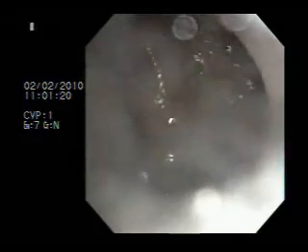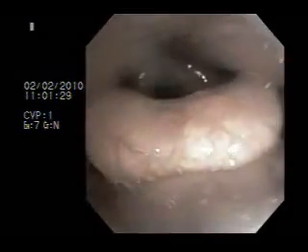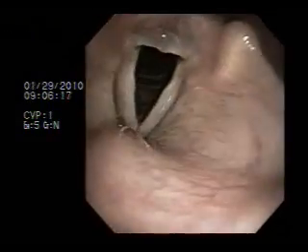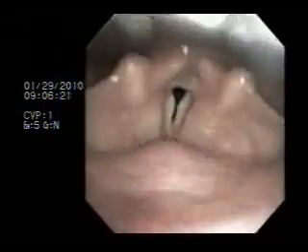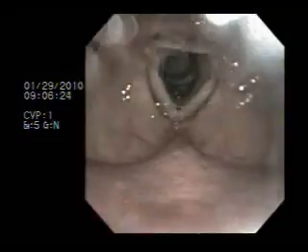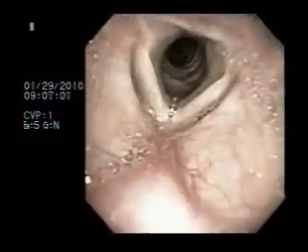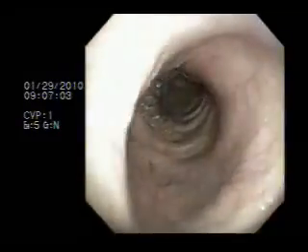The bronchoscope is inserted through the right nostril with the operator standing in front of the patient. The viscous topical anesthetic obscures the view as the scope is passed gently beyond the middle meatus and past the uvula until the epiglottis is seen. The topical anesthetic is then sprayed gently onto the vocal cords, numbing the larynx completely. Keeping the scope well centered, the bronchoscope is passed between the cords into the subglottic region of the upper trachea.